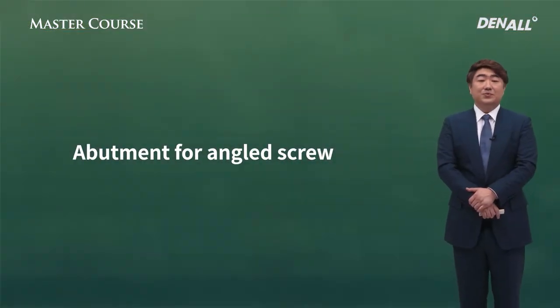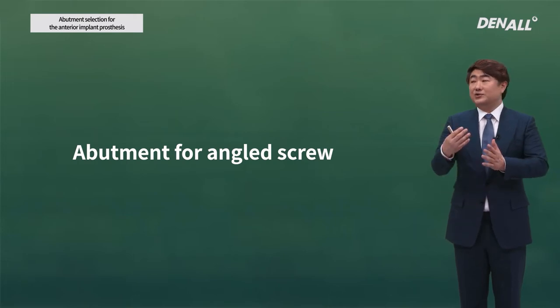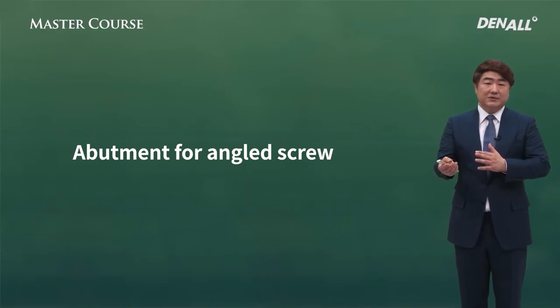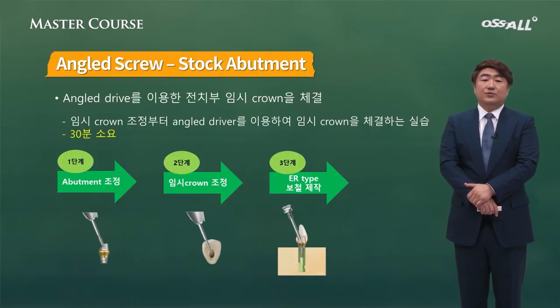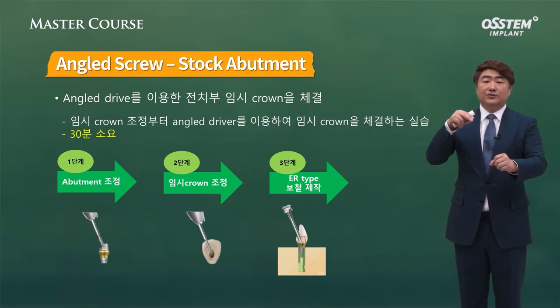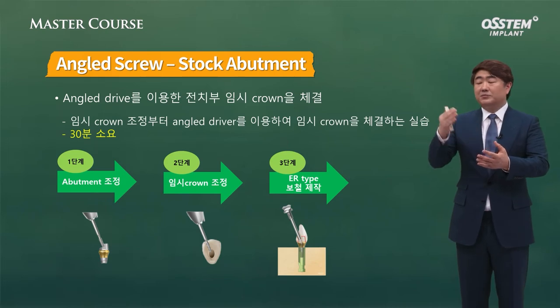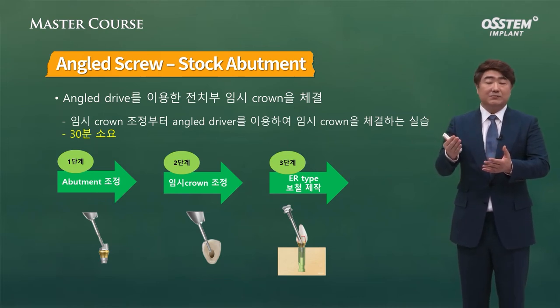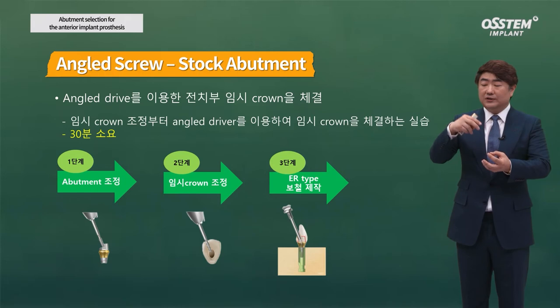Next, on the anterior side, if it's the ER type, which has retrievability, and you want to use that, then of course you can deliver the screw on the palatal side and it will be okay. If not, you have to use an angled screw. For an angled screw, the screw hole in the abutment needs to be a bit angled. So manually, you have to do a bit of cutting, especially with the stock abutment. And depending on where you cut, you also have to create a hole on your prosthesis.